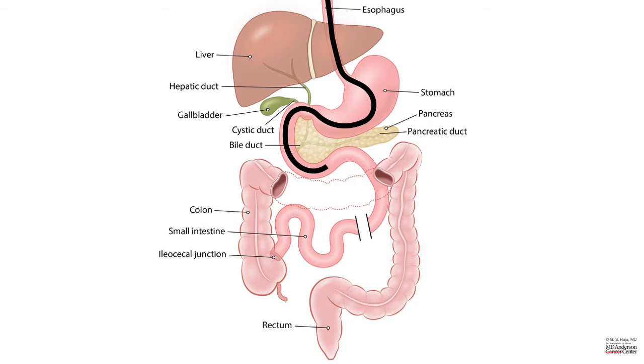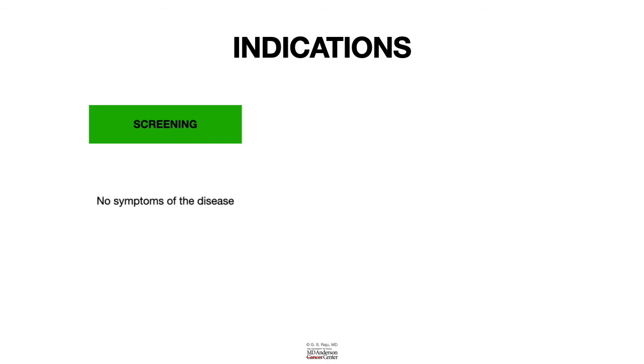So let us look at indications for EGD. EGD could be used as a screening procedure in patients who do not have any symptoms or signs of a disease, and you are screening for a particular condition. We will go over that.